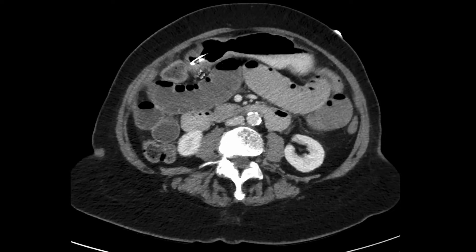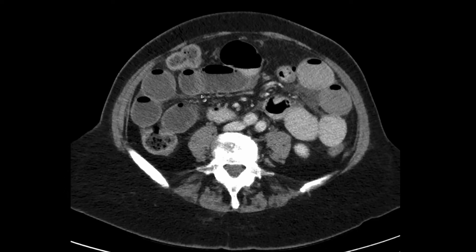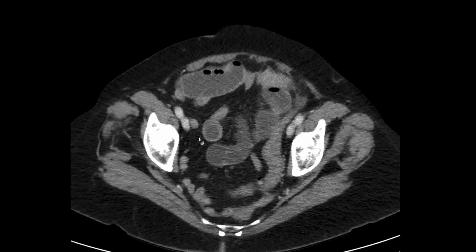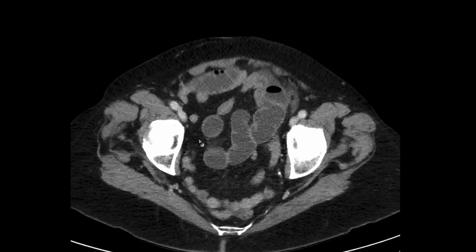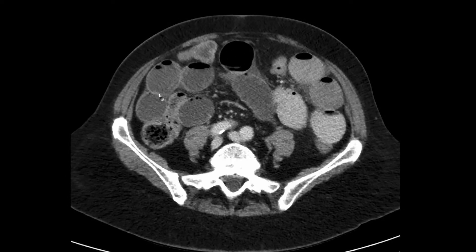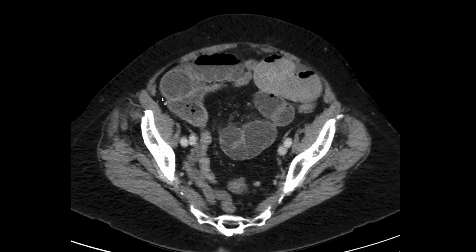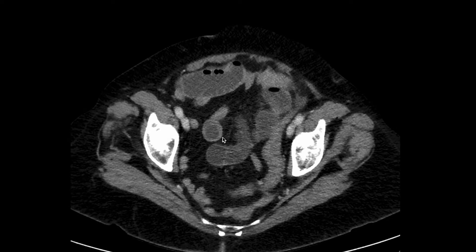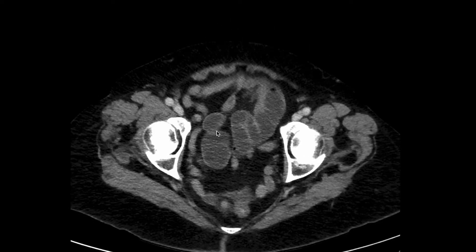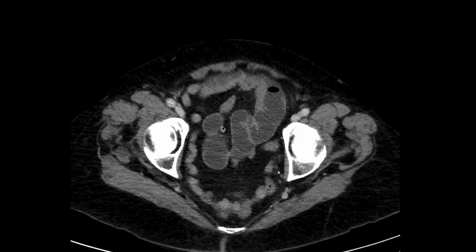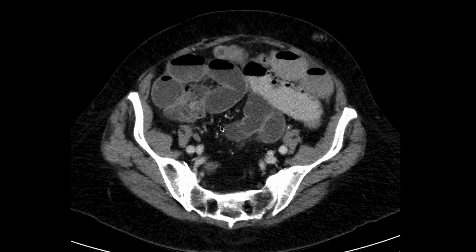As we go further down, we can see dilatation of the small bowel, which raises the possibility of a small bowel obstruction. If there is a fistulous communication between the gallbladder and the small bowel, a gallstone could pass through into the small bowel and become lodged in the distal small bowel, resulting in a bowel obstruction. And in fact, when we scroll into the pelvis, we can see an ovoid structure within the small bowel, which is a gallstone. This results in a small bowel obstruction, also known as gallstone ileus. This requires surgical management.